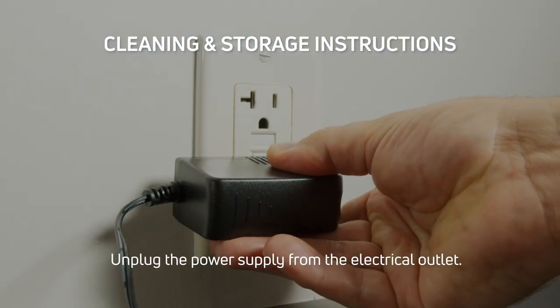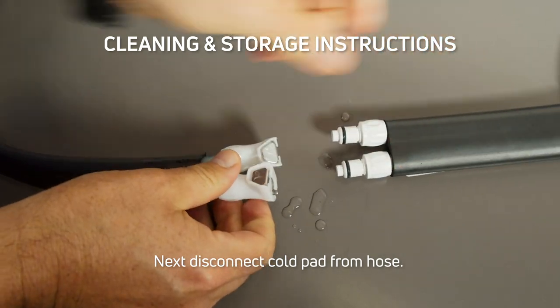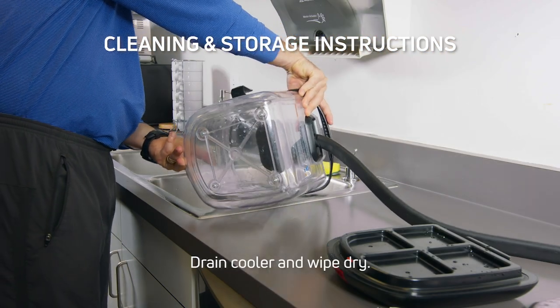Unplug the power supply from the electrical outlet. Next, disconnect the cold pad from the hose. Drain the cooler and wipe dry.